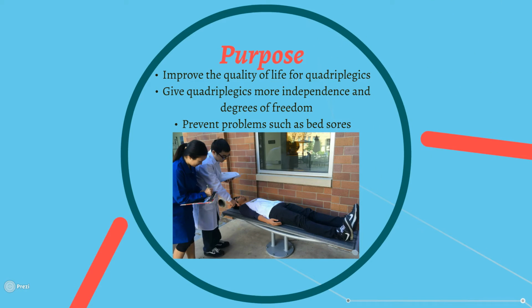The purpose of the device is to improve the quality of life for quadriplegics by giving them more degrees of freedom and independence. Also, it will prevent injuries such as bed sores with its flexibility.